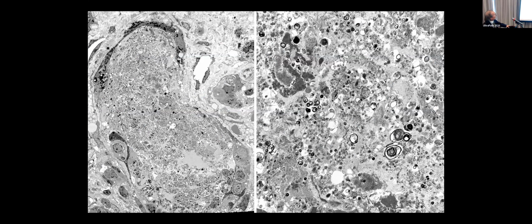Again, there's all this material at low magnification, and high magnification here. It's not difficult to speculate that all this material represents cytoplasmic fragments that belong to the degenerated neutrophils again. There is a background of fibrillary material representing a background of uromodulin.